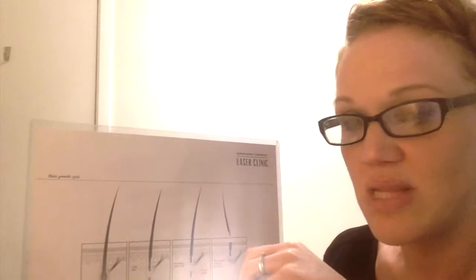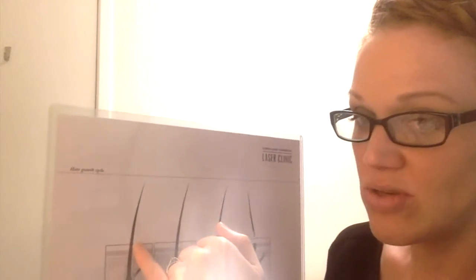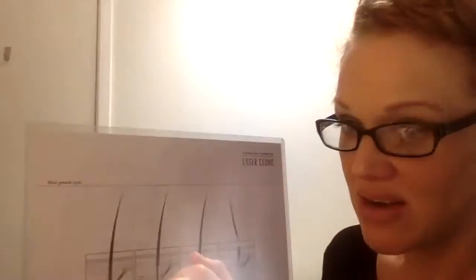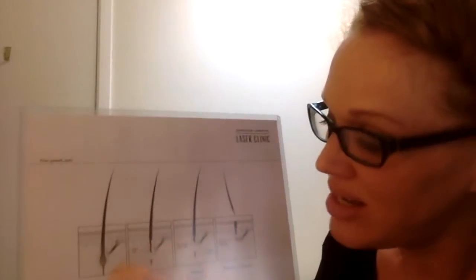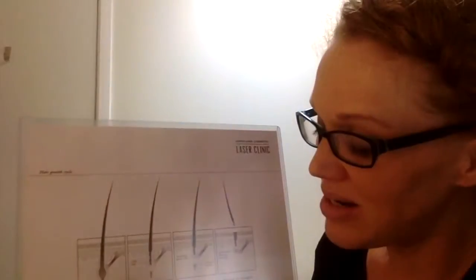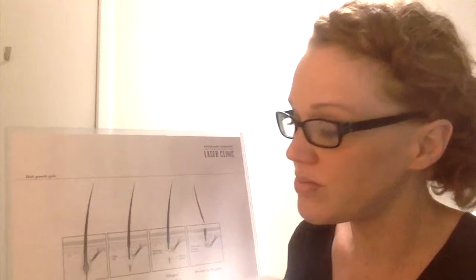But only the hairs in the anagen phase are really effectively treated with the laser, because when the hair's in the anagen phase, the laser energy is absorbed right down that hair shaft, deeply into the bed of the follicle, and the presence of that bulb means that there's plenty of melanin right down in the follicle bed. So much so that we can heat up and thermally damage, effectively cauterize, that tiny little blood supply, and also damage the growth cells on the follicle wall. So that's how we damage that follicle enough to effectively permanently shut it down.